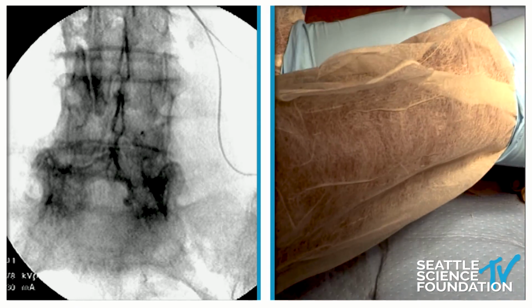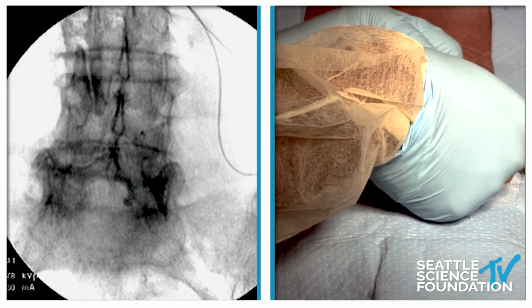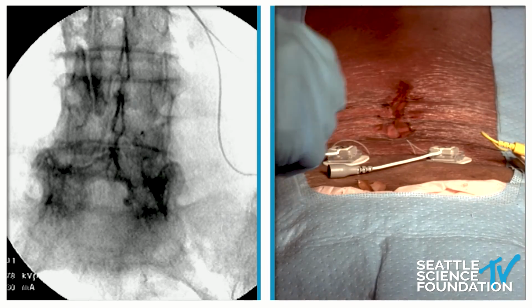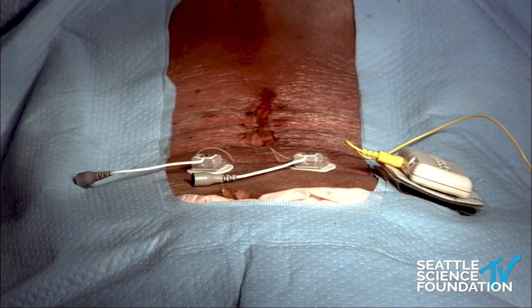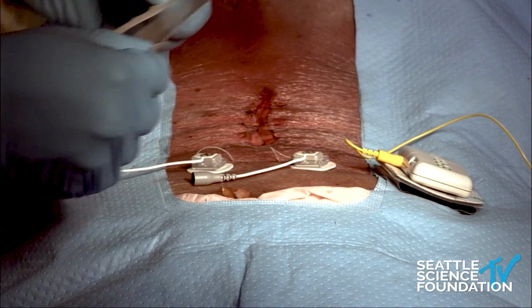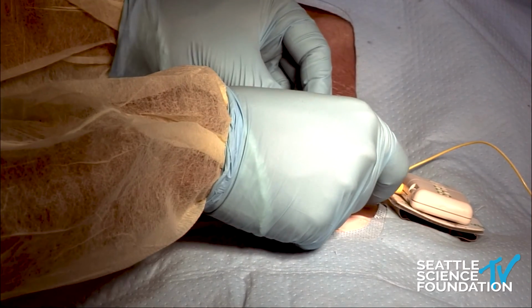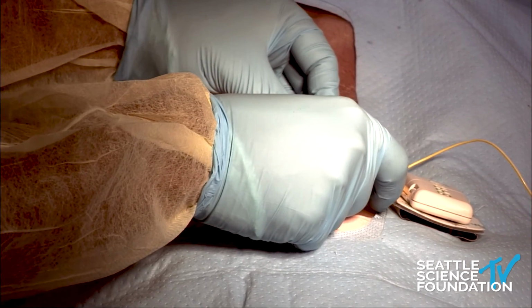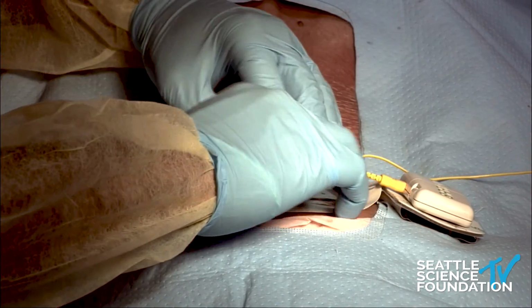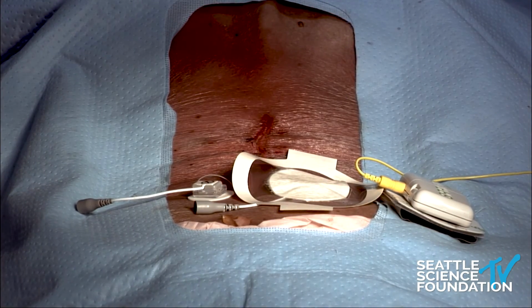Well, let's get this guy out of the way. Beautiful. And then we'll take our circular tegaderm. And again, this is all Dermabond. And the reason to have these tegaderms is that you obviously don't want to stick down over the insertion point. So I will just lay this down. We'll take this out of the way. And I won't stick this side down because you can see that insertion site's right there. So I'll take the second one.